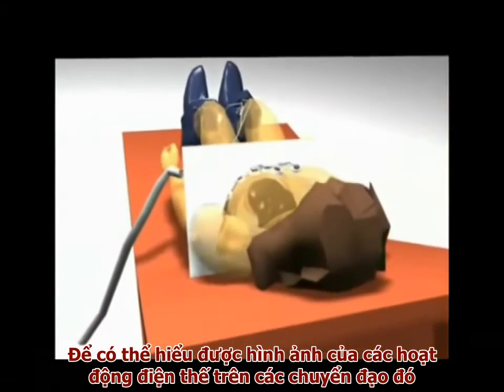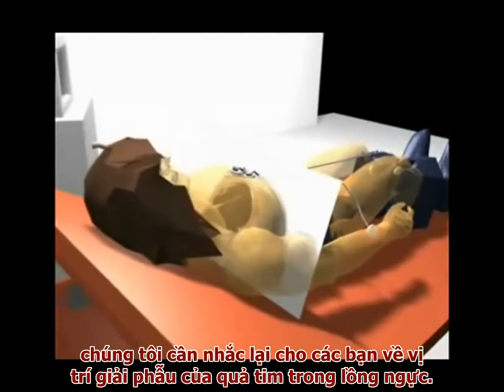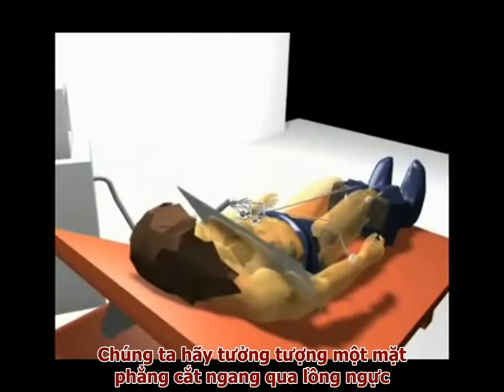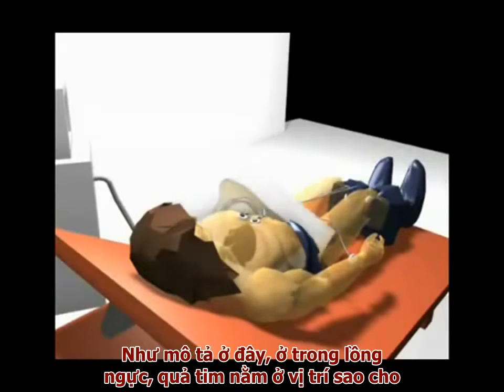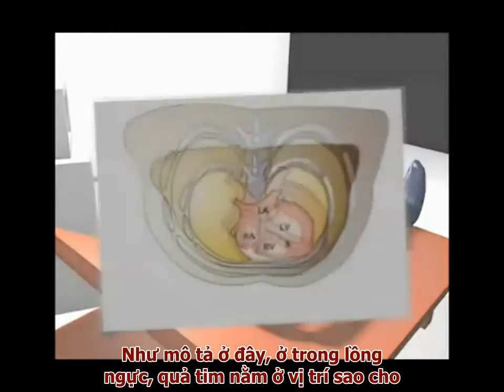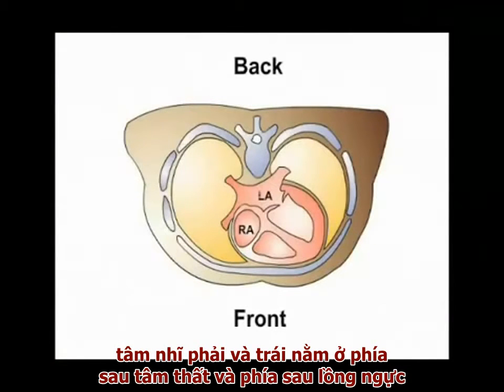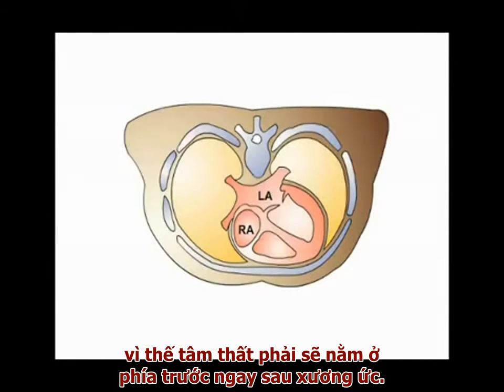These 6 chest leads examine the heart in the horizontal plane. In order to understand their view of cardiac electrical activity, we need to remind you of the position of the heart in the chest cavity. Let's examine a horizontal section of the chest taken at the level of the chest leads. As illustrated in this section through the thorax, the heart is positioned such that the right and left atria sit behind the ventricles at the back of the chest. Furthermore, the organ is rotated towards the left, so that the right ventricle lies anterior to the left, immediately behind the sternum.